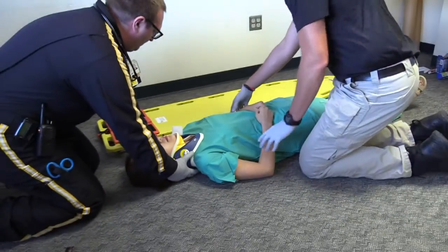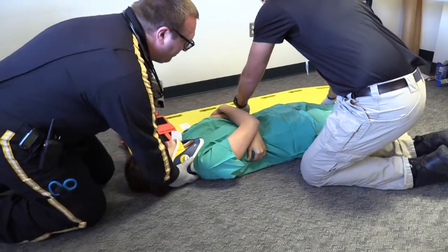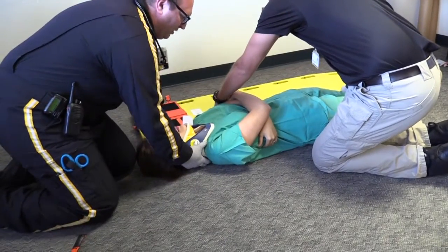I will then position the long spine board next to the patient, ensuring I have removed the straps from the patient's side of the board. Rolling the patient onto his or her side may take additional team members to prevent lateral movement of the patient's spine.